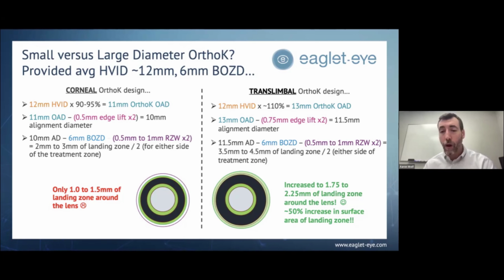I think that you can always go smaller. There's no trick or real difficulty with making your treatment zone smaller. Either lens can go really small, but not both lenses can always go really big in that regard. So this is just a nice little summary between the two.